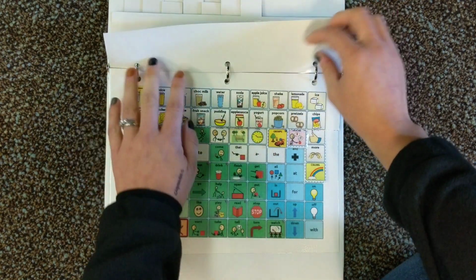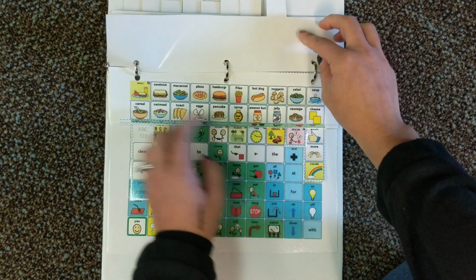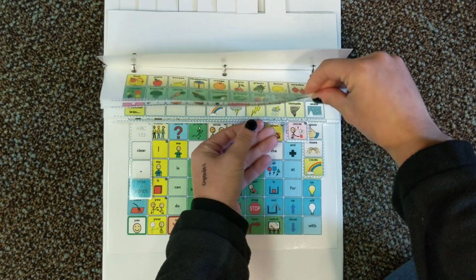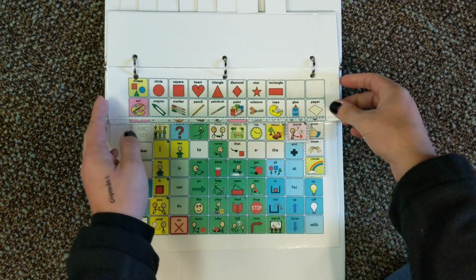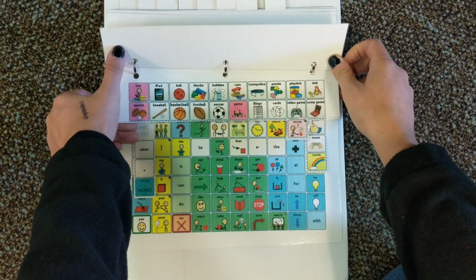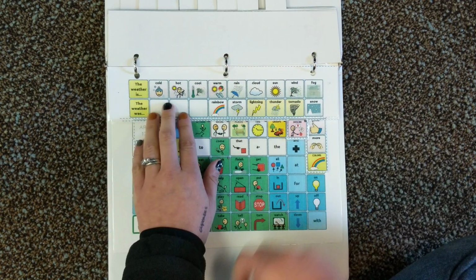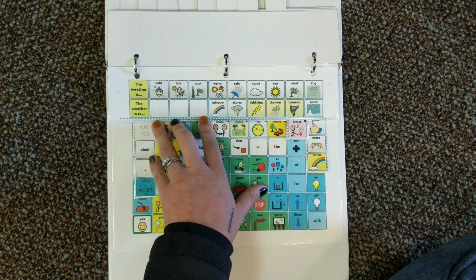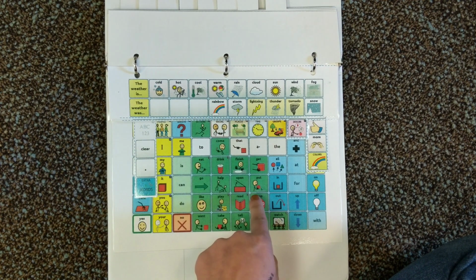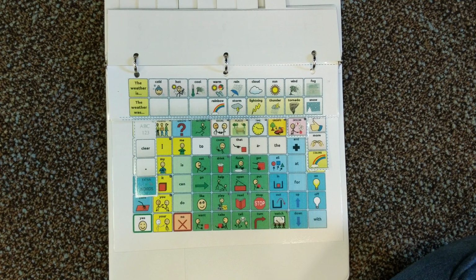Then you get to the groups. So in groups on Chat Editor, there'll be different groups. Like there's a food. So this is some of your food. Food's pretty important for our friends. Then there's a group like shapes and art. A group about the body. Group about toys. Group about the weather. So this is another great tool for when we're in calendar. They can say the weather is cool and sunny.